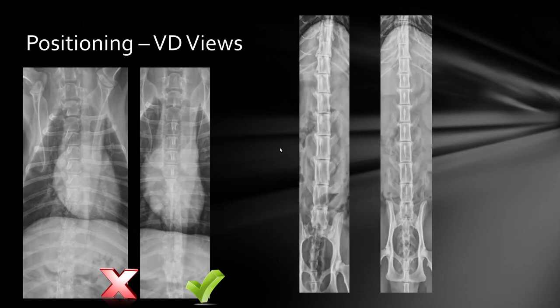These are examples of oblique positioning. So you see on the left side here, this is the thoracic spine notably rotated. You see the spinous processes are deviating to the right. You actually see the sternum projected off to the left here. So this patient will have to be rotated so his sternum is shifted more towards the right. And then the radiograph was repeated and was much straighter. And now we have our spinous processes in the middle of the vertebrae.